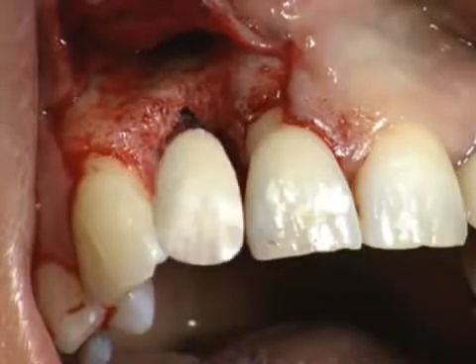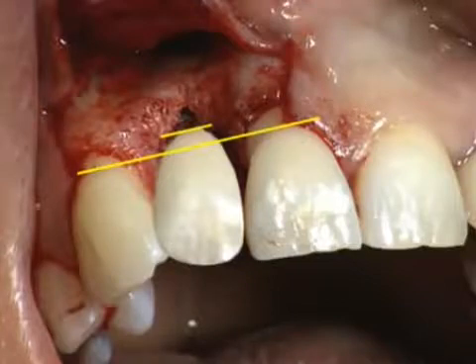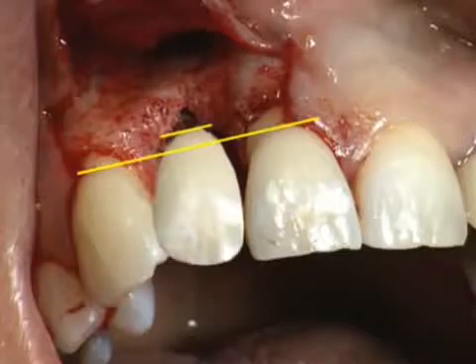In aesthetically important areas, the implant shoulder can also be placed 1 millimeter deeper than the enamel cementum border of the contralateral tooth. This position allows an optimal emergence profile of the future restoration.